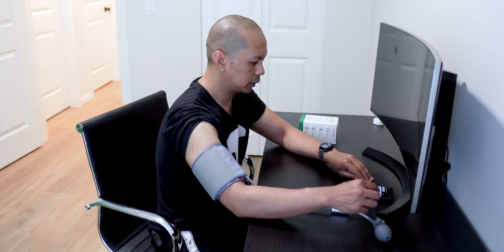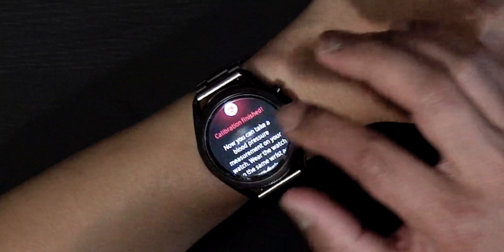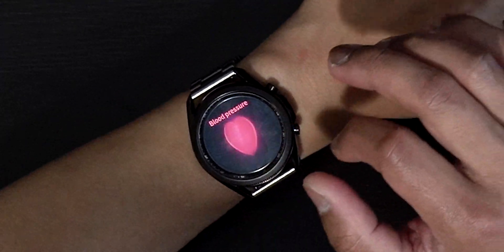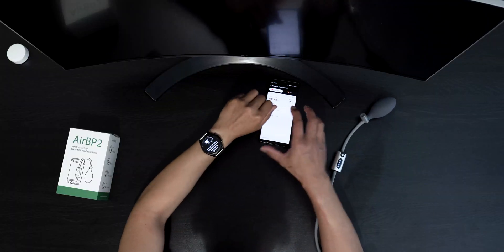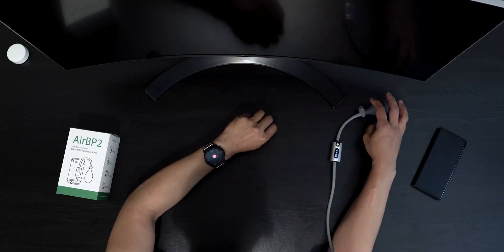Now we can go to the app and compare it. We can start measuring now — we don't need the cuff anymore and we can measure on the watch now.